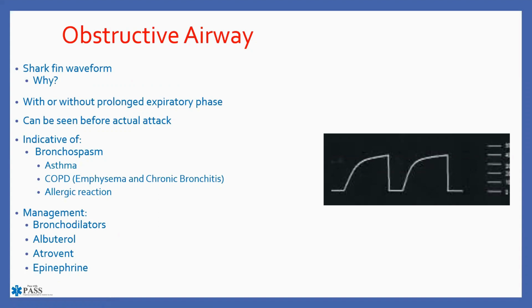If you have that patient in your district that you're familiar with, you go there, they're the real McCoy, and they tell you that they're having some difficulty breathing, put them on capnography and look at that. You'll actually be able to capture the severity of the obstruction pretty early on. And then after you have managed, and we'll talk about that here in just a second, after you have managed, then maybe you start to see some relaxation, and the shark fin appearance start to go away.